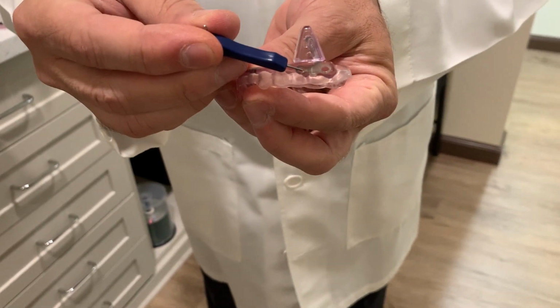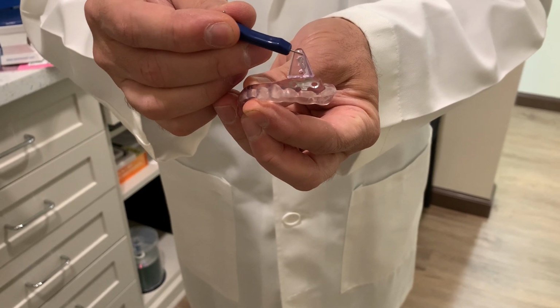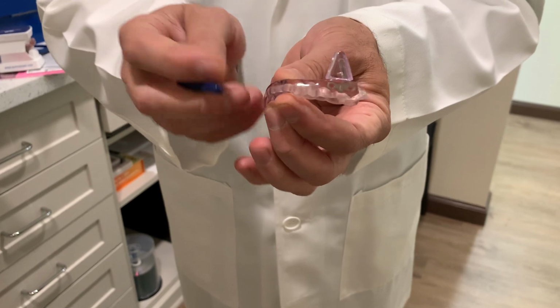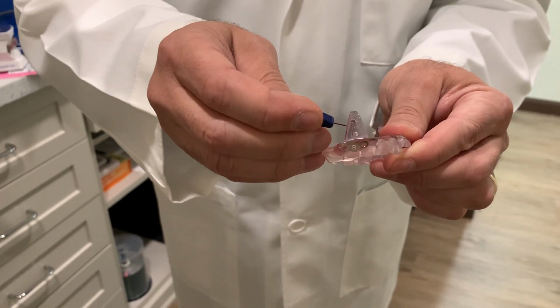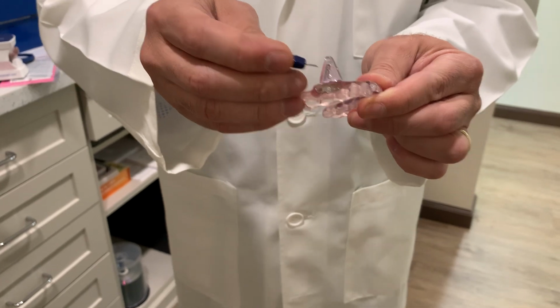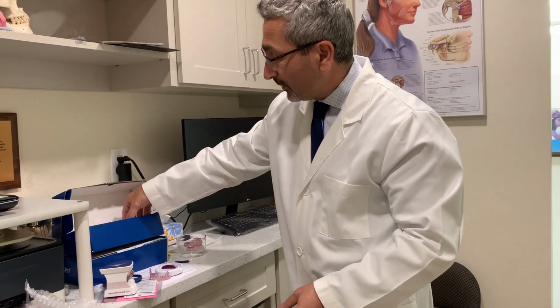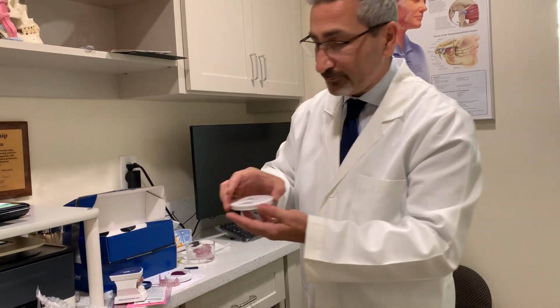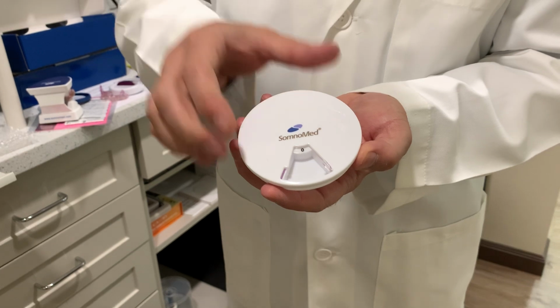So what you're going to do here, as I bring this closer, if you look closely in the middle there, there's an L carved into that side for left. And up here it says L0 in the plastic. Looking on this side in the middle, there's an R for right side and R0. So as you come back to your little container here and look at it, those were zeros on the mouthpiece.